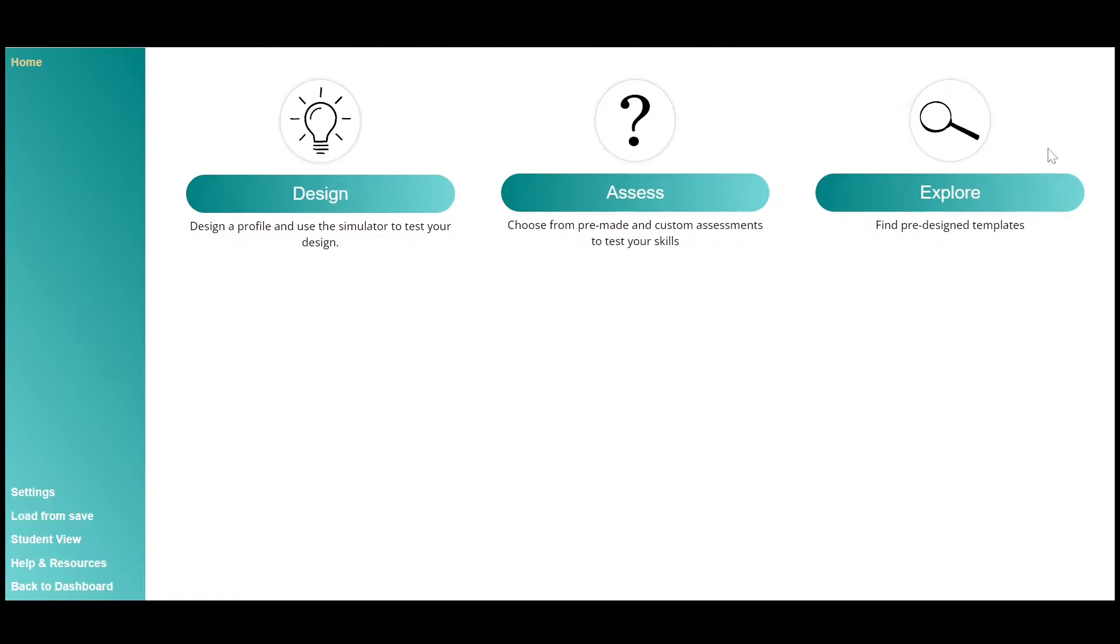Once you're inside your course, you can design your own case, complete assessments, or explore designed cases.